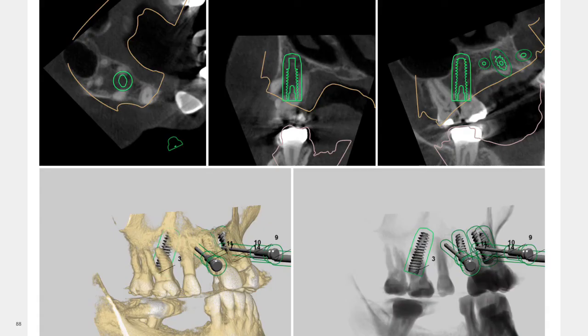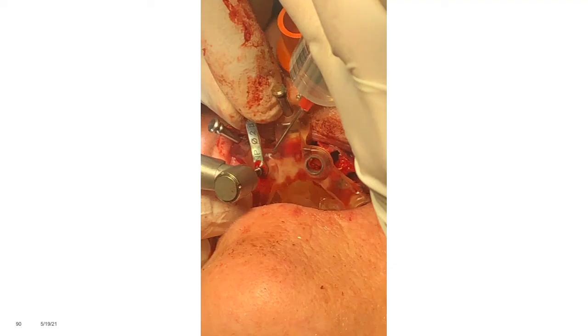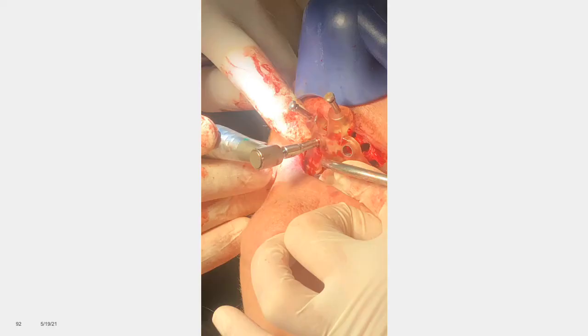As you can see, they'll tell me exactly where to place these implants and how long they are. So we're guaranteed a perfect angulation afterwards. They'll even tell me the multi-unit which I should use in order to make sure that it comes through in a prosthetically pleasing area. This is an example. We actually did this a few weeks ago where we have the guide pinned on after we take out the teeth. It's pinned on, can't move. Literally the implants just zip in. It literally is cut by numbers.